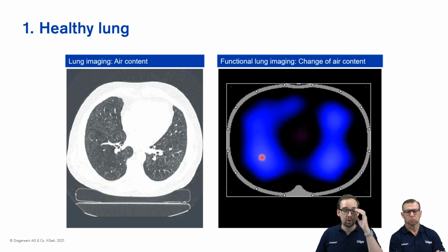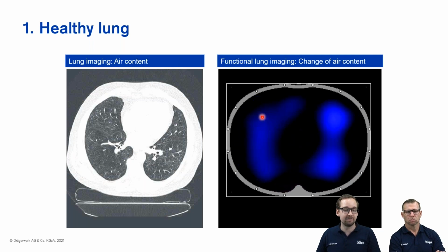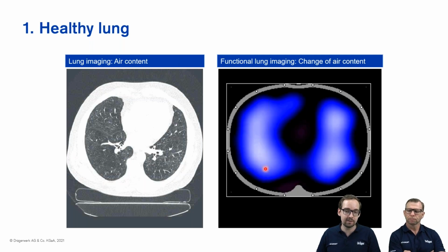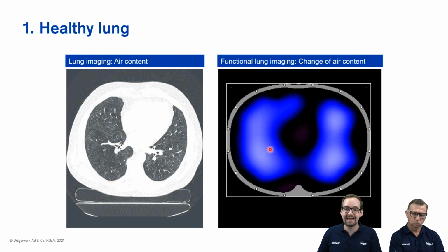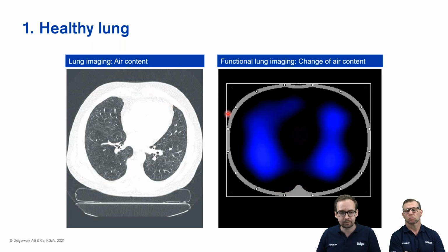Usually the regions with the best lung compliance are in white, because air takes the path of least resistance. Therefore we see in these regions the most tidal volume going to those compartments with the highest compliance. This is the very fundamental difference between CT and EIT.